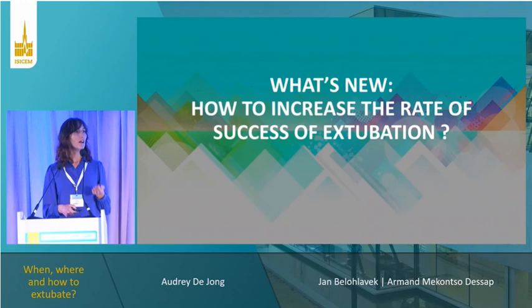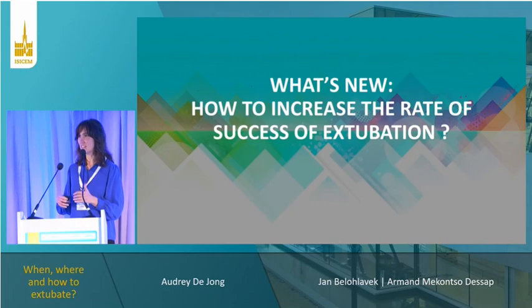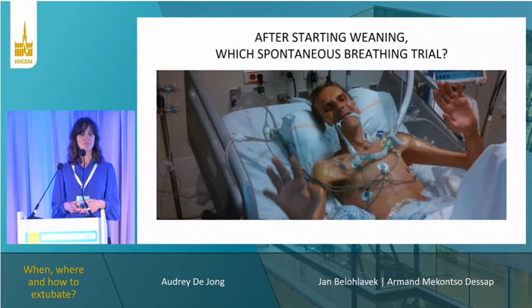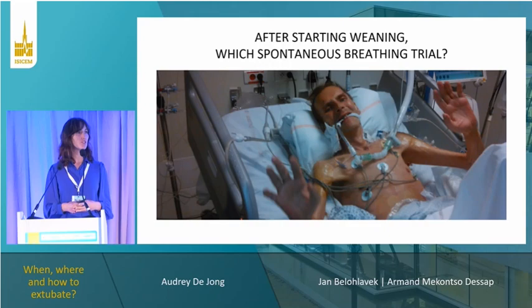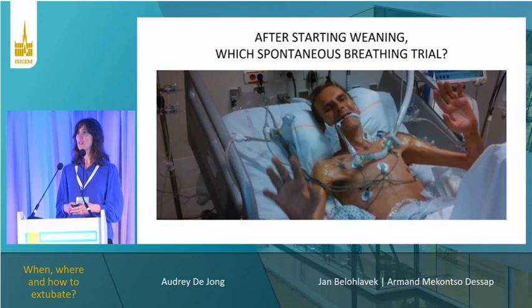So what's new? How to increase the rate of success of extubation? I will only present recent data about the means to increase this rate of success. First, after starting weaning, of course, I had the consent of the patient for the picture, after starting weaning with a spontaneous breathing trial. It was a patient with pancreatitis, and he spent almost 1 year in our ICU.